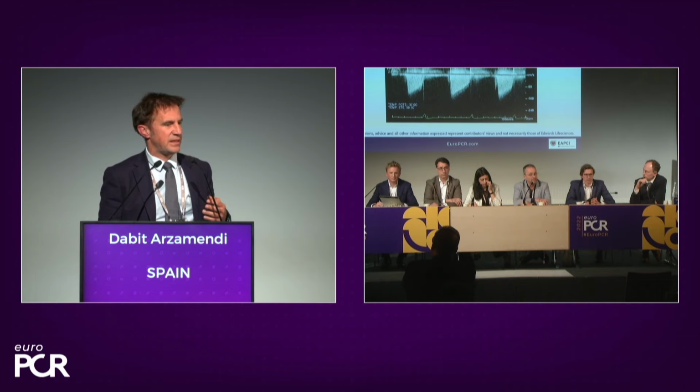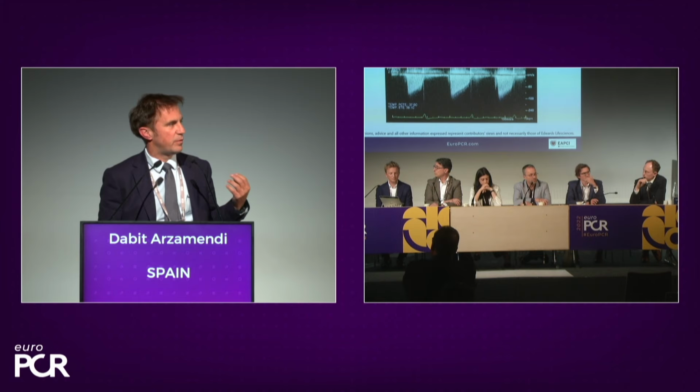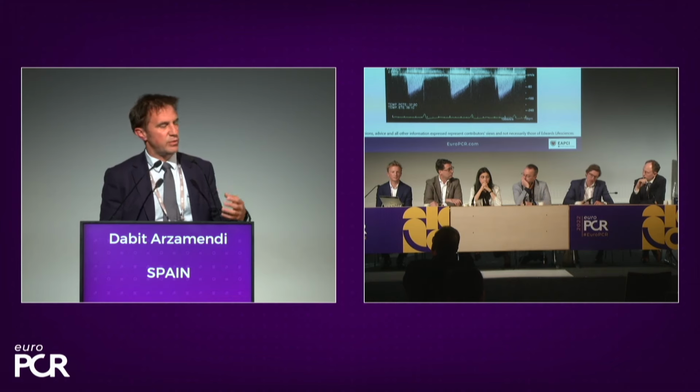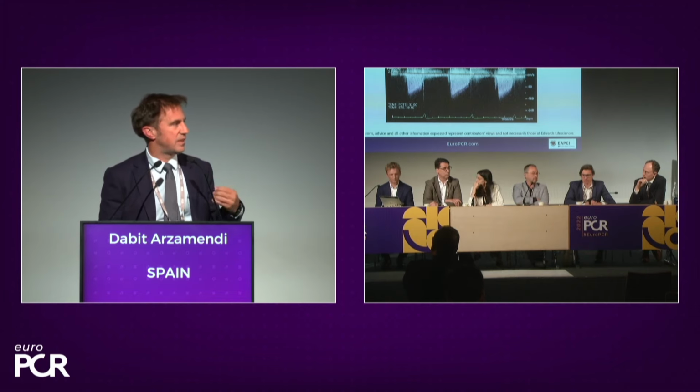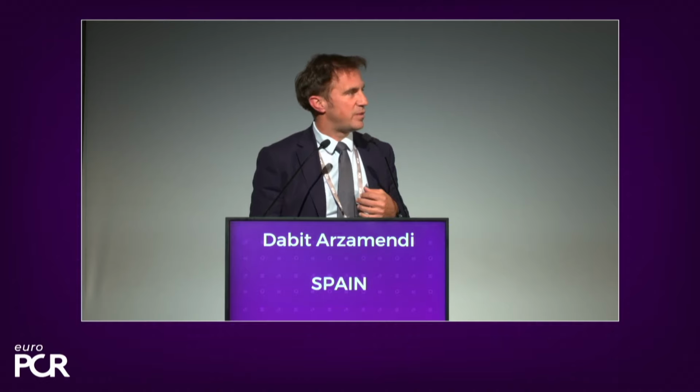I think the good thing of Pascal is that you can predict the result before you release the device. So if the amount of tissue is not good enough, you will have a residual MR before you release, so you realize that it's not enough. In this case, we went almost down to 3 point something, so it's pretty on the limit. But the device was really stable, and we have a good result. I think, and we have already discussed also in this meeting, that this optimization is a good weapon for us, because you can optimize, you can reassess, you can do several attempts. The other thing is that it's really a soft device, so you can do several grasping attempts without damaging the leaflet. So there are several positive things that can allow us to have a better result. The number, it's difficult to say.